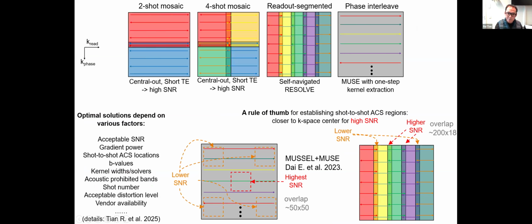They first do LORAKS in the K-space center, a lot of LORAKS, iteratively, and then they do another MUSE operation like a Hamming filter in their open source code to get the phase maps. So our case just unifies their two steps into one. You don't need to do this iteratively with LORAKS. With a central 50 times 50 region, you can extract this phase map in one step.